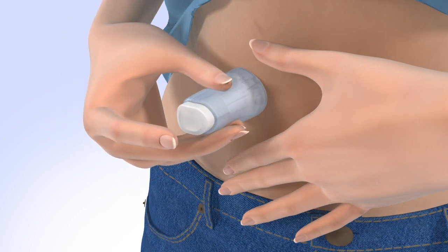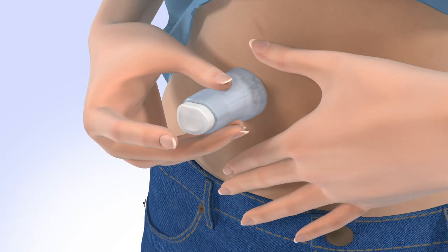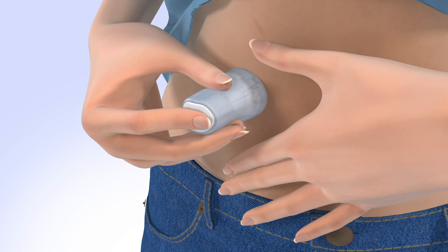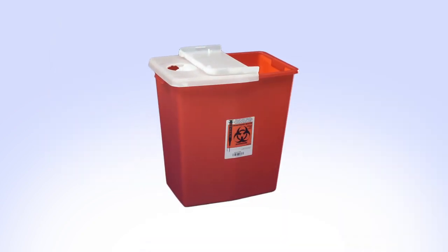Stretch your skin until it is smooth. Place the insertion device flat against your body over the prepped site. Do not pinch up your skin. The raised arrows indicate the side where the tubing will be connected. With the insertion device secure against your body, firmly press the top button to insert the set. Carefully pull the insertion device away from your body. Safely dispose of the used insertion device.